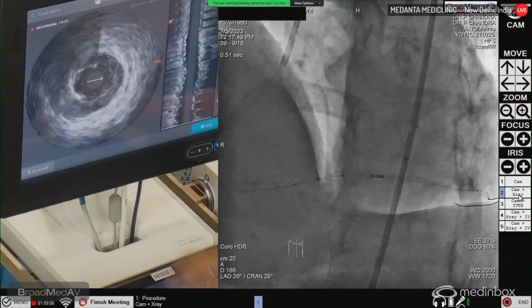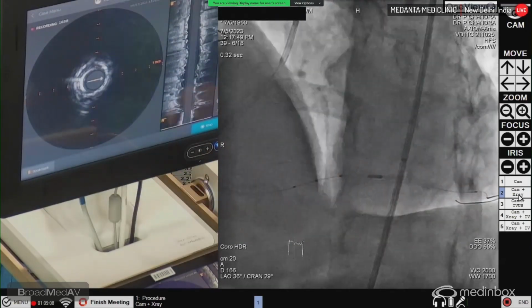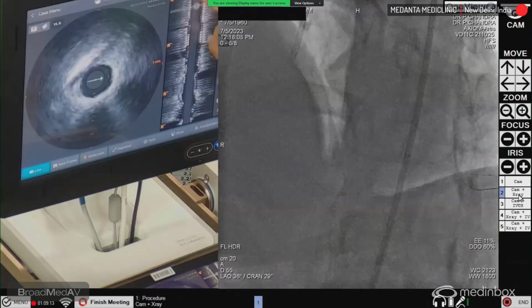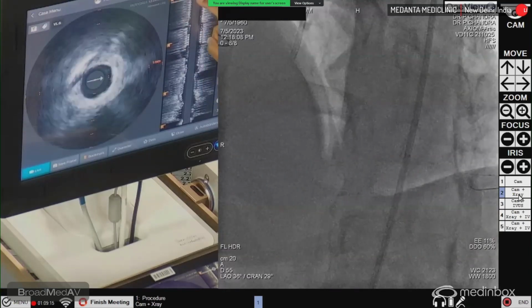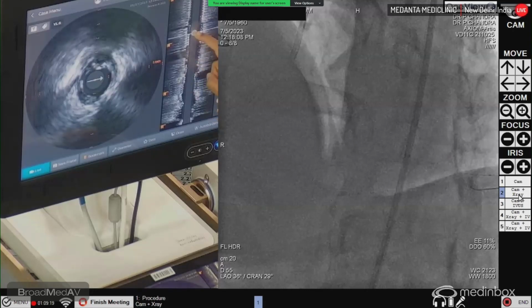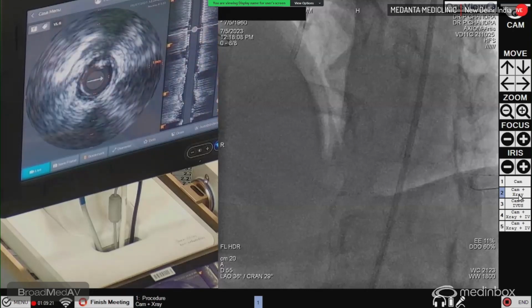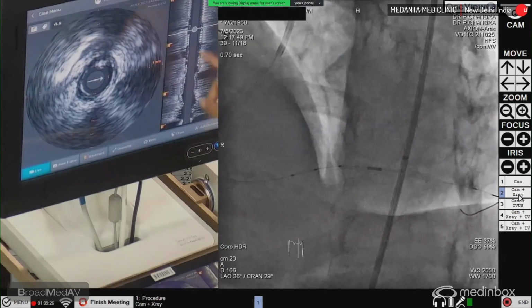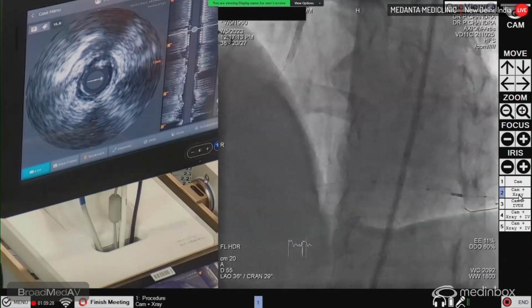Yeah, very nice. Okay. RCA proximal lesion also, sir. We can check, but I think it should be okay because we have been moving quite easily. And show me the distal. Show me the angio picture on angiographic image. This looks quite good. Okay. Go back. Go back. 2.7. Go back.